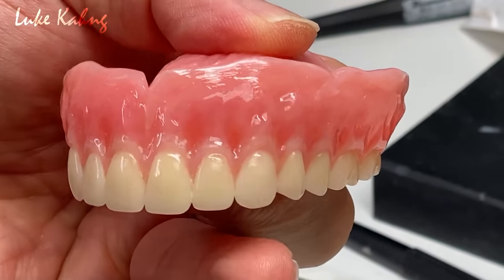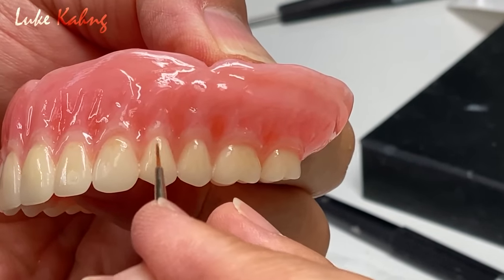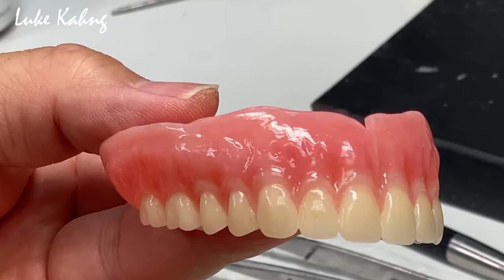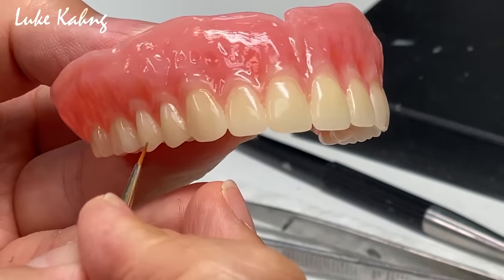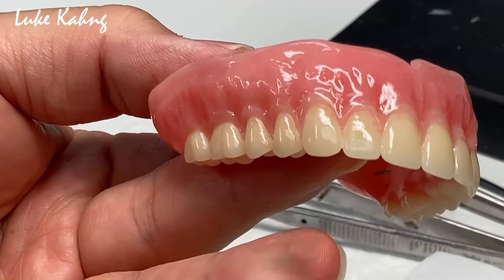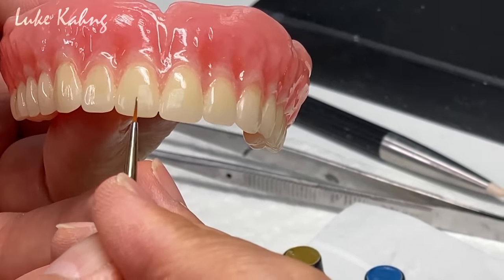Just a little bit darker, the gingiva area, just a little bit, okay. That was good, right? No, too much. Here, that was good. You can do with the ivory, with the incisor. You see? Yeah.